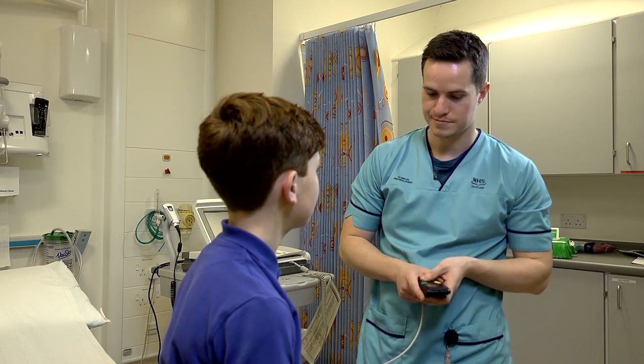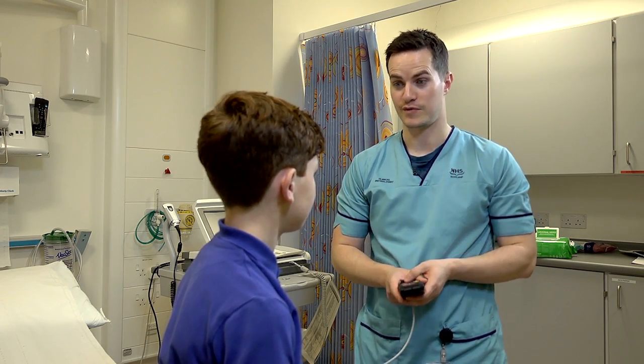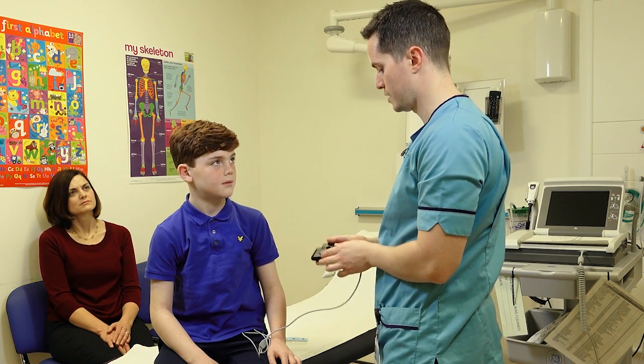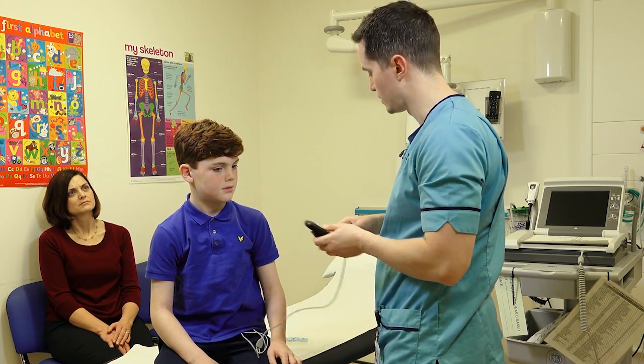In terms of how you wear it, you can really wear it wherever it's comfortable for you. It is small enough to be put in a pocket, or it's got a little clip so you can attach it onto whatever you're wearing.